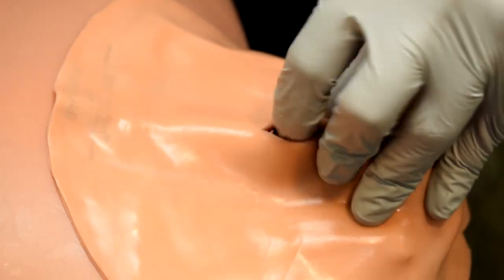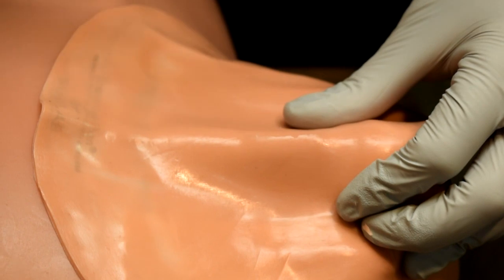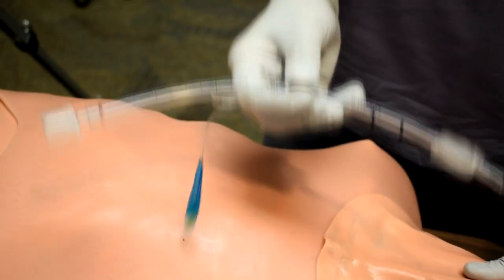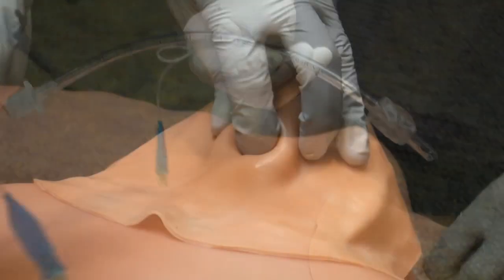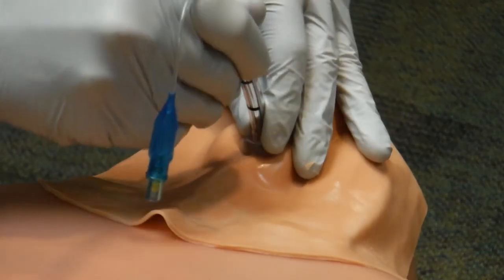And I can feel the airway is open, and at this point, I can insert my ET tube, which should be a 6 millimeter ET tube or less. And what we're going to do is we're going to feel our anatomy, and we're going to guide the ET tube into the hole.